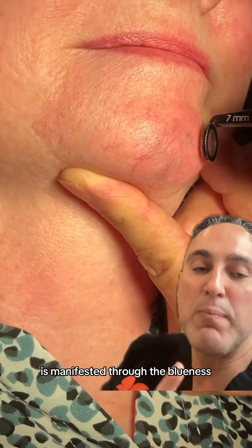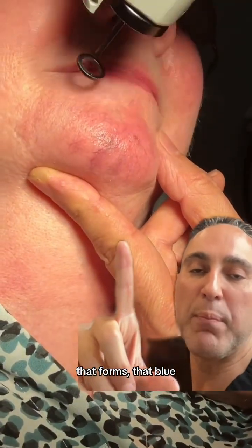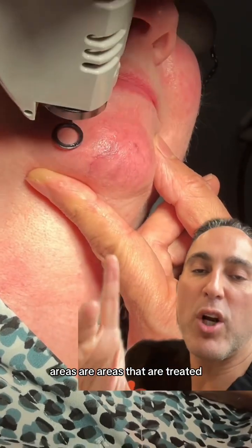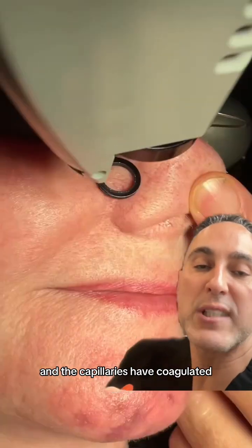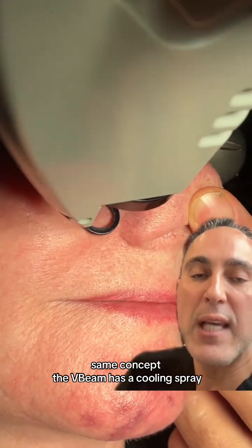Some of it you can see is manifested through the blueness that forms — those blue areas are areas that are treated and the capillaries have coagulated. Here we go on to treat the nose also, the broken capillaries, same concept.